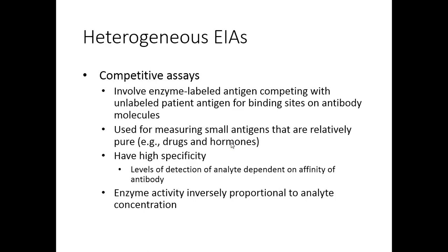The competitive assays, we understand that they use enzymes with the addition of a substrate, again, to measure and detect the analyte. A couple of reminders for us. Competitive assays use enzyme-labeled antigen to compete with unlabeled patient antigen for those limited numbers of binding sites of antibody molecules that have been immobilized on the solid surface, right?